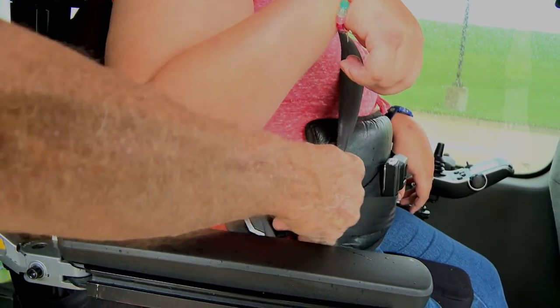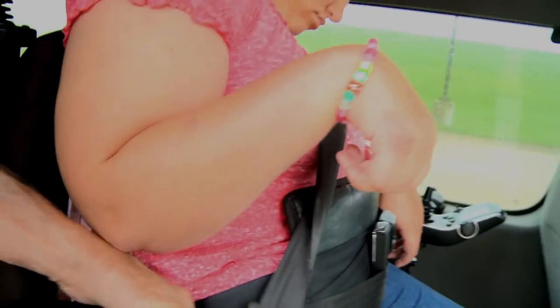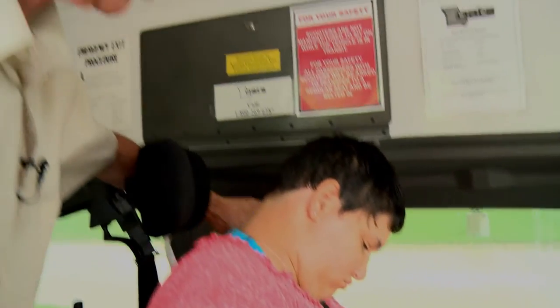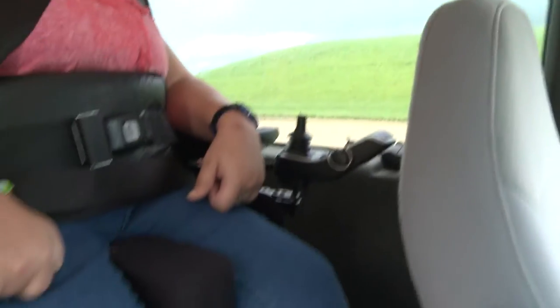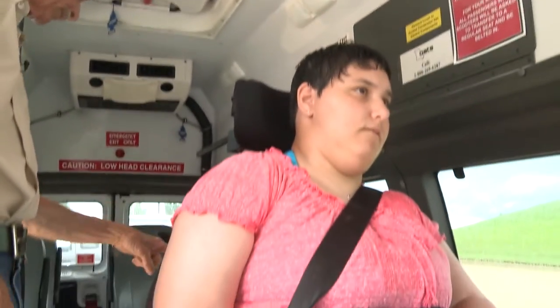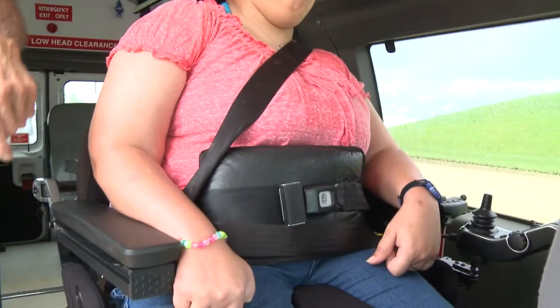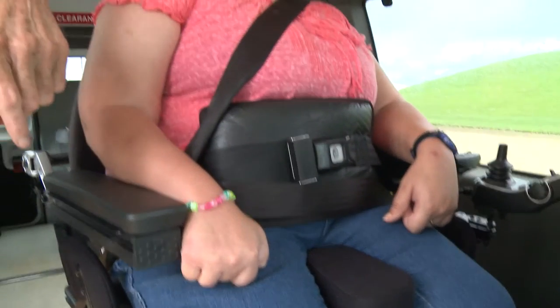We need to make sure this red button is not near the rider's hip — and it looks like we've got a good position. The shoulder belt is not up around her neck. We've got Ashley properly secured. We're going to check our work now — looking: one, two, three, four mobility aid securement points properly secured to the floor and the mobility aid, and we're looking for five, six occupant restraints properly secured keeping Ashley in the vehicle in the event of a crash.